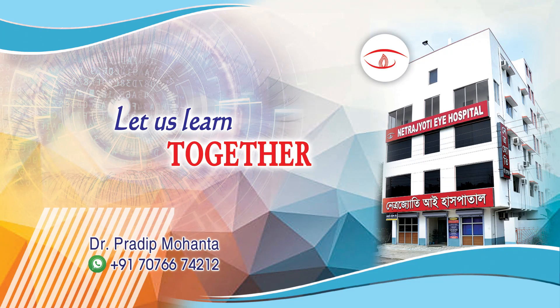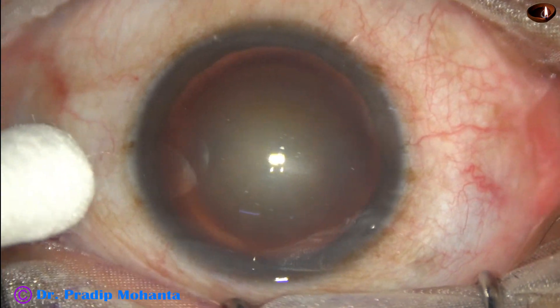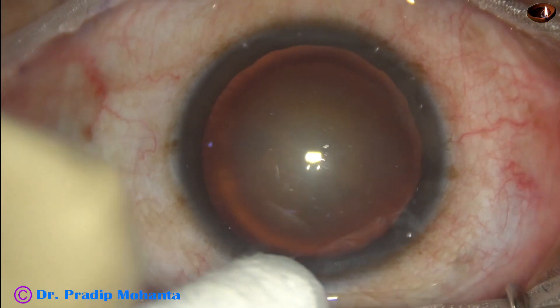Friends, welcome to my workplace for hands-on FACO and SICS training. Let us observe this totally unedited recording of FACO phacoemulsification.